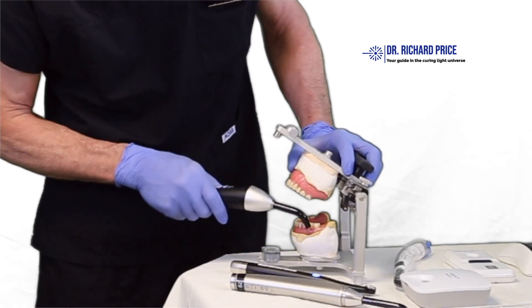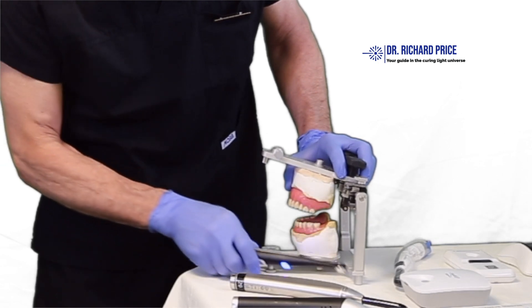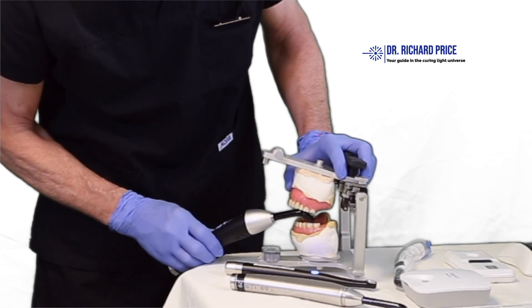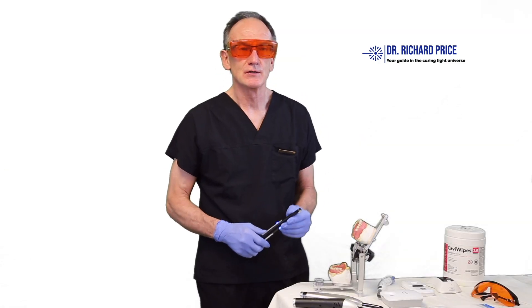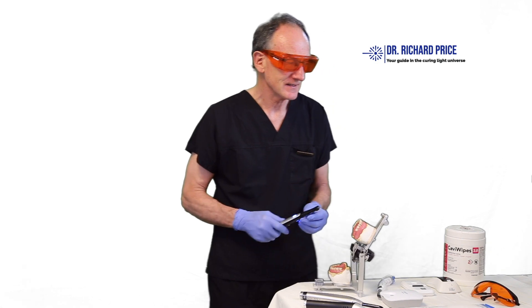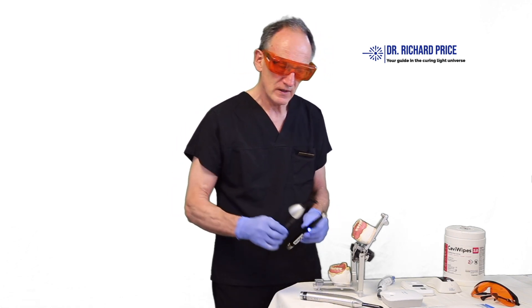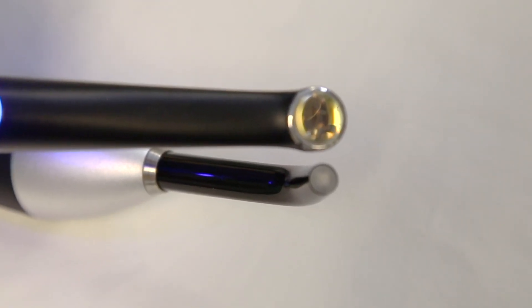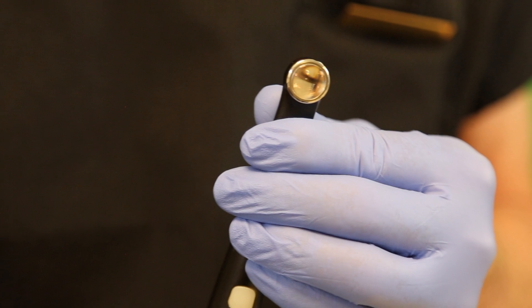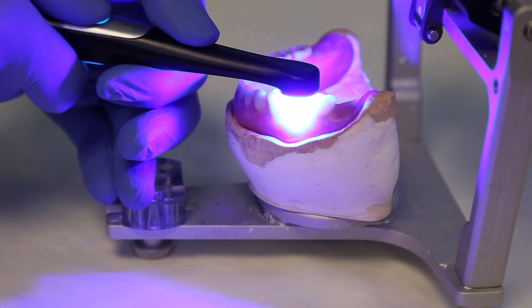Using a curing light that forces you to work at an angle means the restoration will be cured at an angle — the top will be hard but the bottom will be soft. So choose a curing light with a low profile head so you can access the most posterior restorations directly and straight on. When using a light with a bigger head, you can see in demonstration that pretty much the whole tooth surface is lit up in one pass.